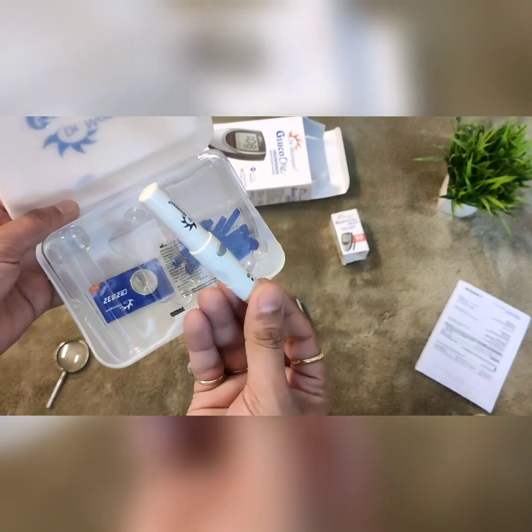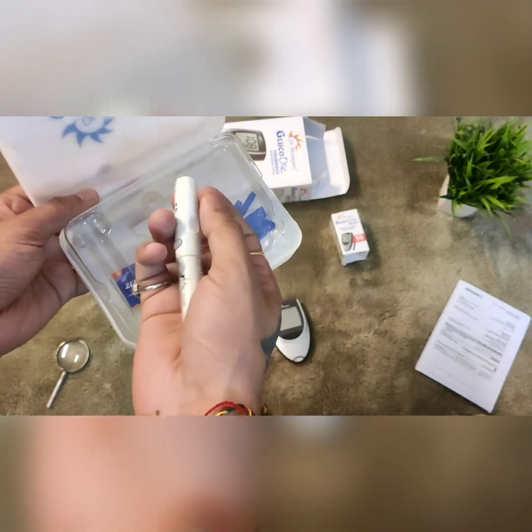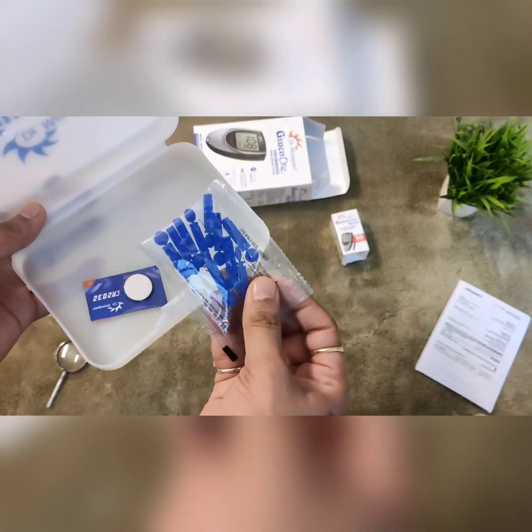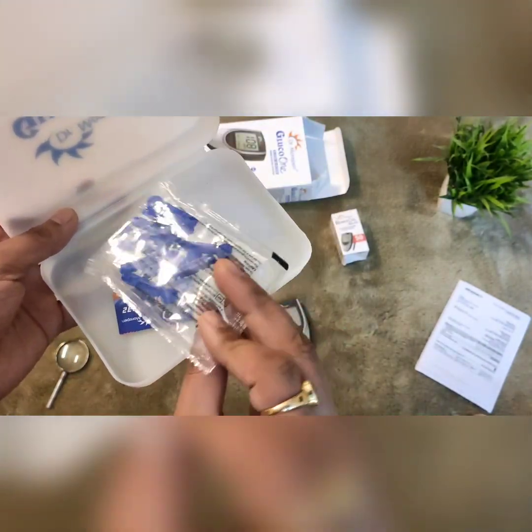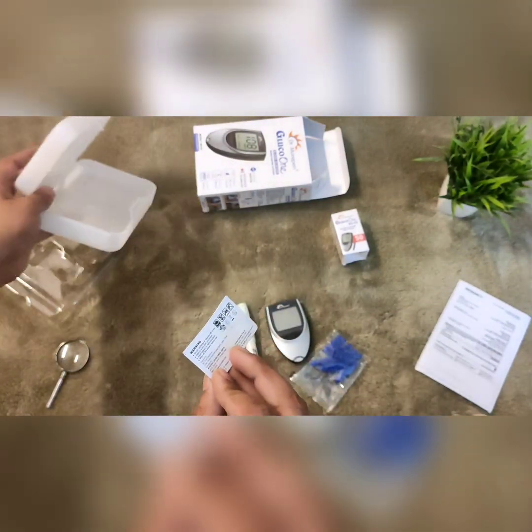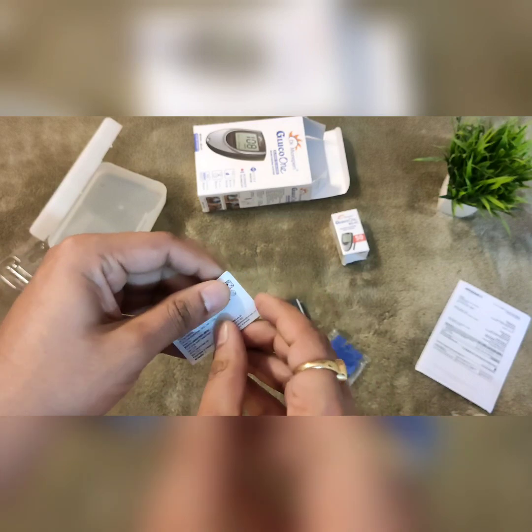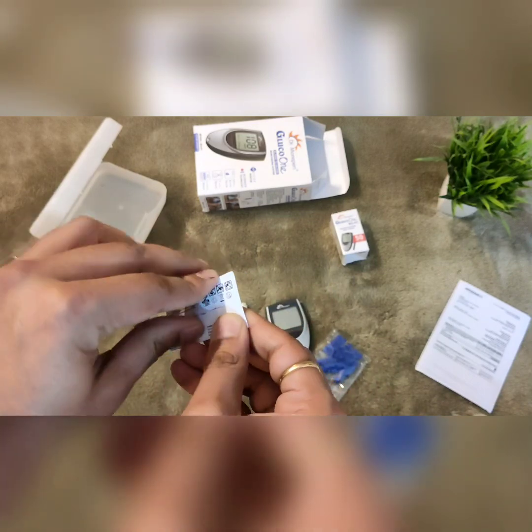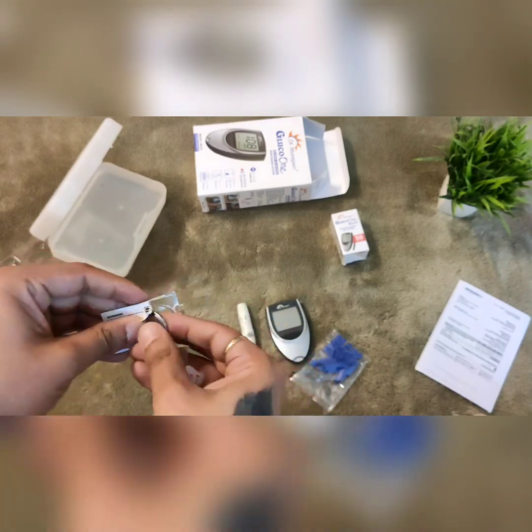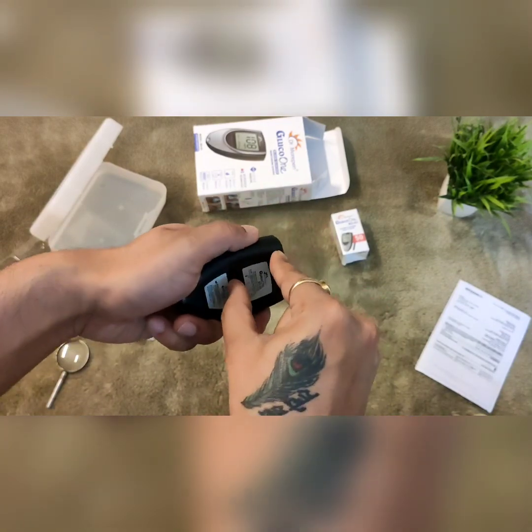This is the lancing device, and this is the lancet. We have also received a cell which we will use for the gluco meter. Here we are going to insert the cell.